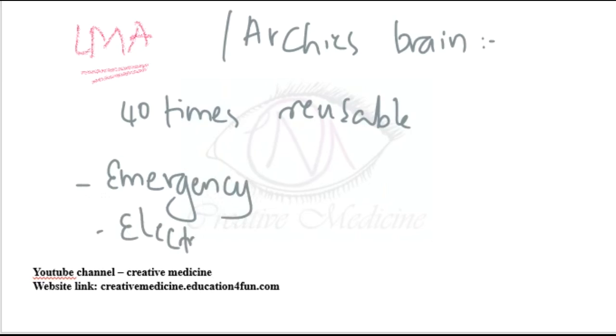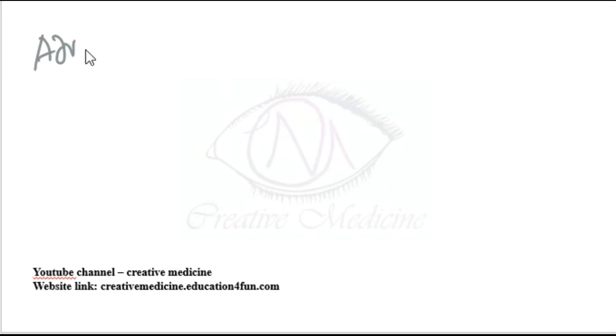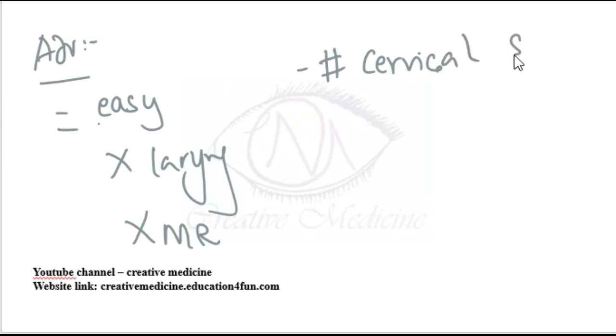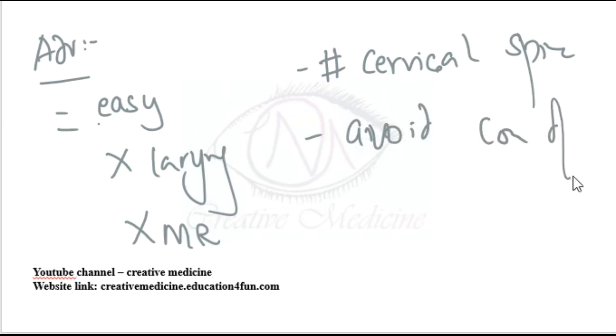Advantages of laryngeal mask airway. Laryngeal mask airway is easy to use. No laryngoscope is required. No muscle relaxants are required. Laryngeal mask airway can also be used in fracture of cervical spine, and it can also be used to avoid complications of intubation.